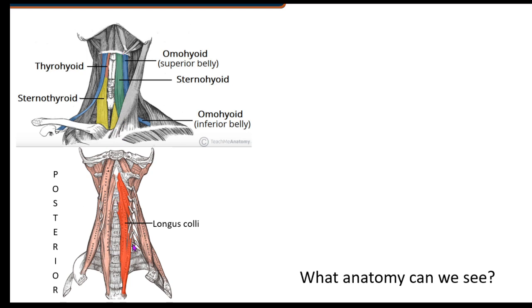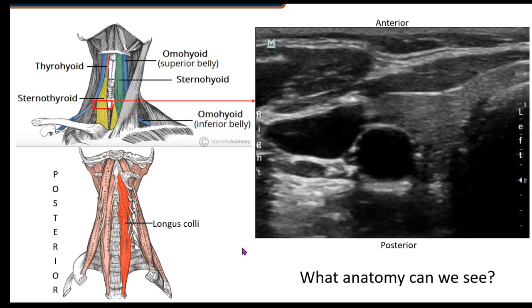I want to point out a posterior muscle that becomes a landmark for us when we're setting our depth to look at the thyroid gland — and that's going to be your longus colli. Longus colli just means long neck muscle, and it runs alongside the bodies of the vertebral bodies.